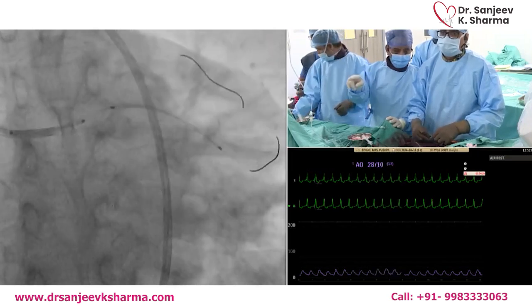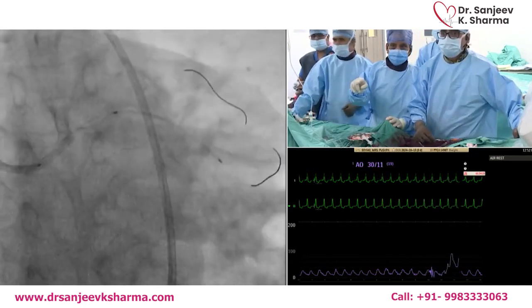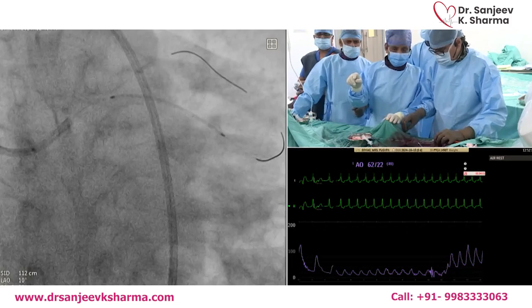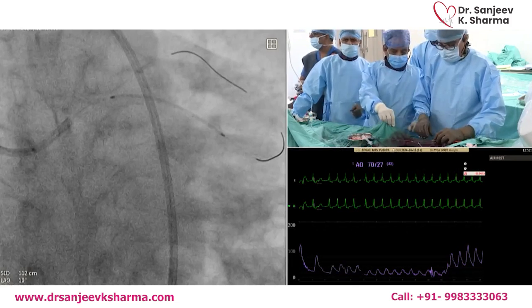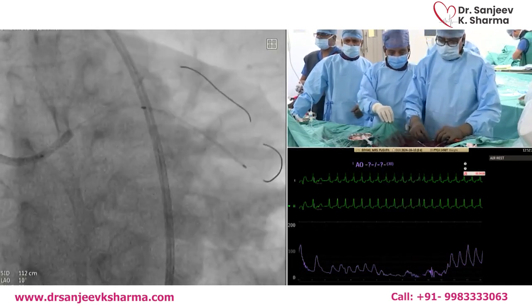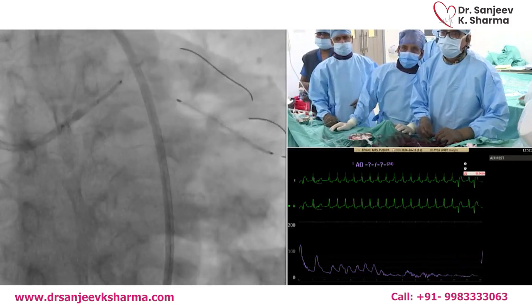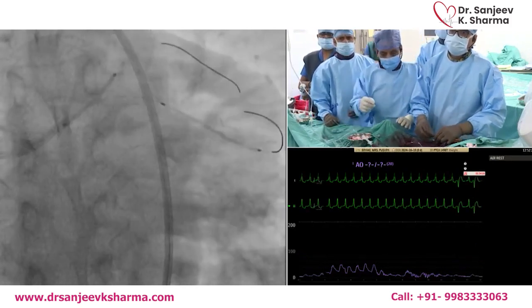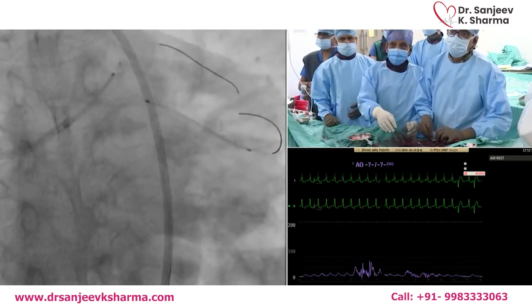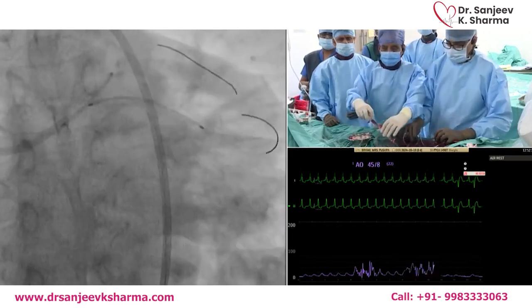Okay. Let's see if it delivers. Usually the delivery of those is more problematic than anything else. In my view, the big stents always have a little trouble with a 7 French guide, for whatever reason. On face value, it looks like they fit. But in reality, not so easy to fit. Sometimes it breaks because it's bent, the hypotube, and it breaks. Actually, I had a case here yesterday where I overdid it. Okay, good. So we are ready to take a picture.